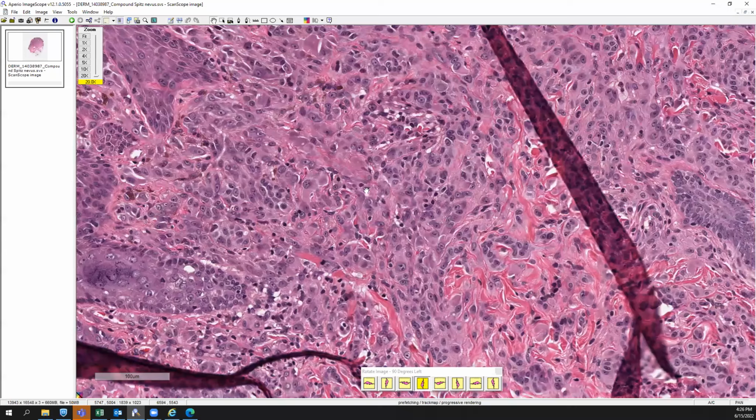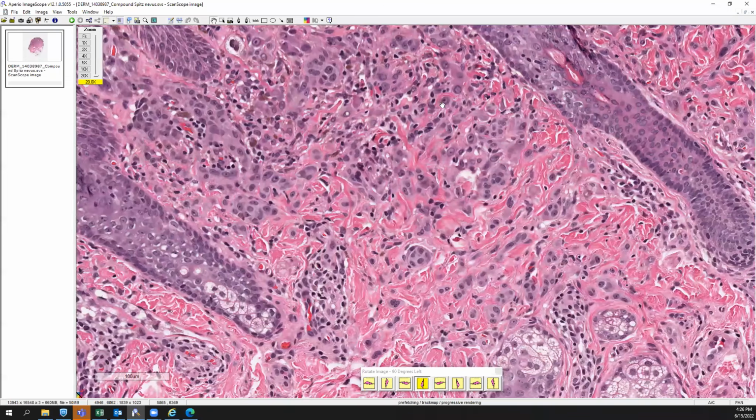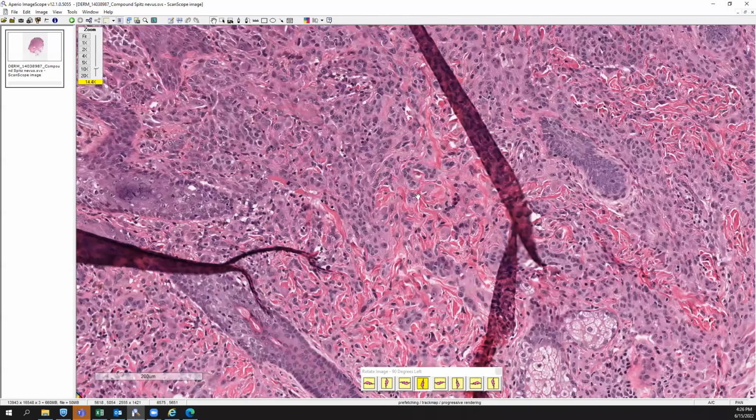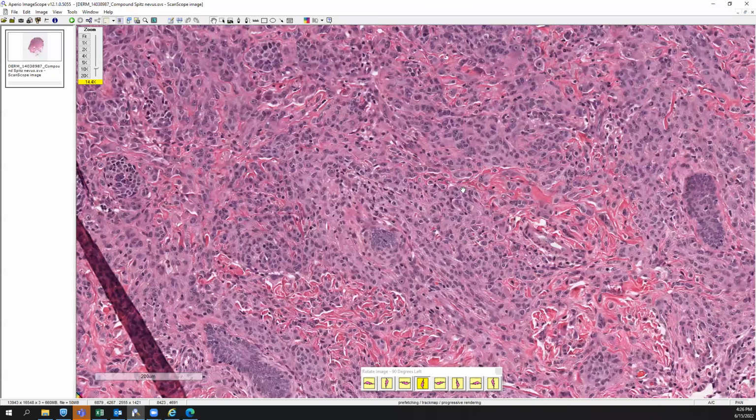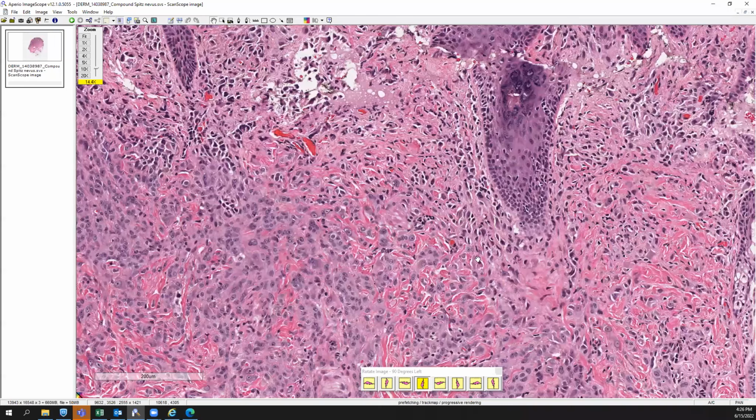The next stain that you'll consider is a P16 stain. These are often retained in benign melanocytic proliferations. Now it's not 100%, but if you have broad retention of P16, then it's somewhat supportive of benignity. So that would be a useful immunohistochemical stain to do.